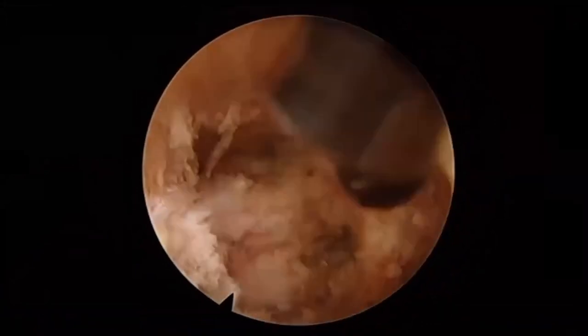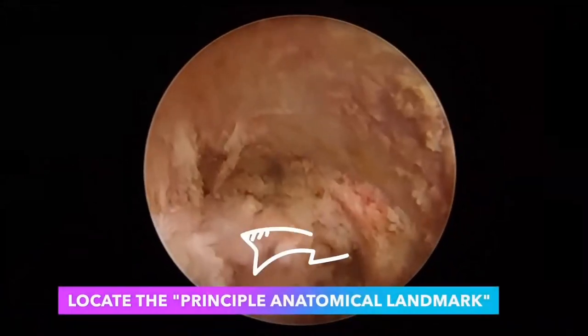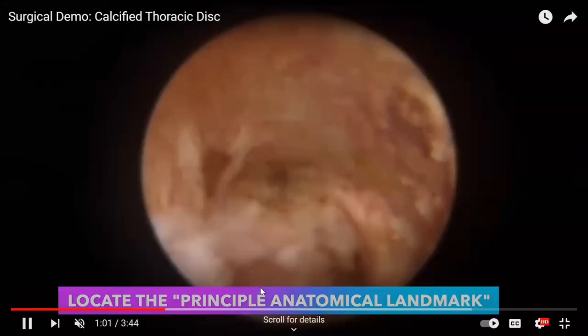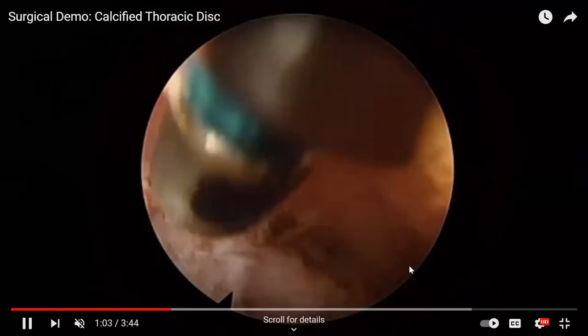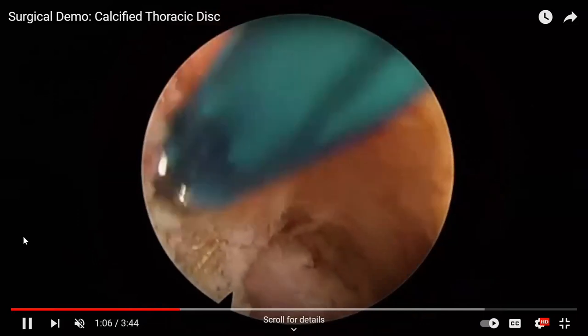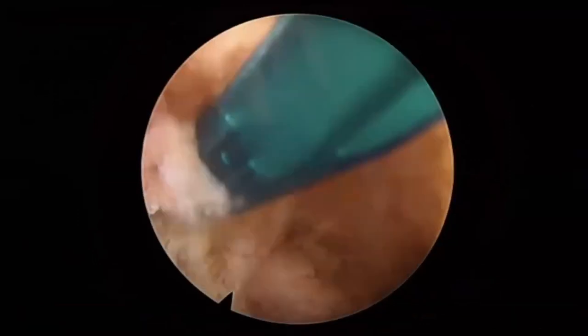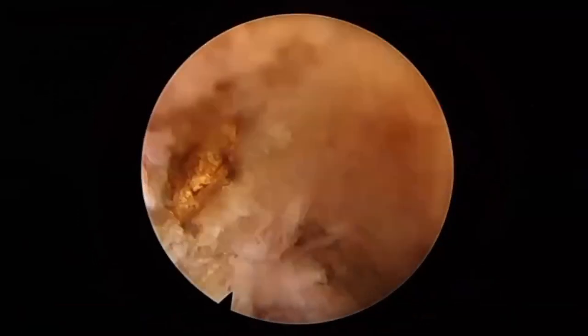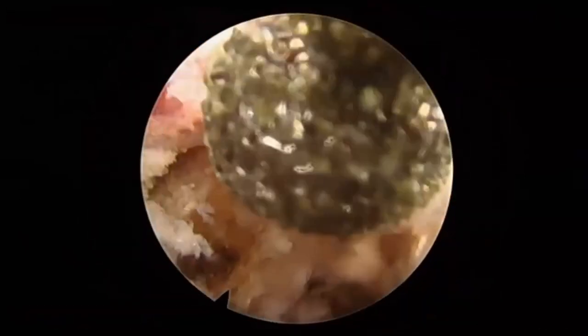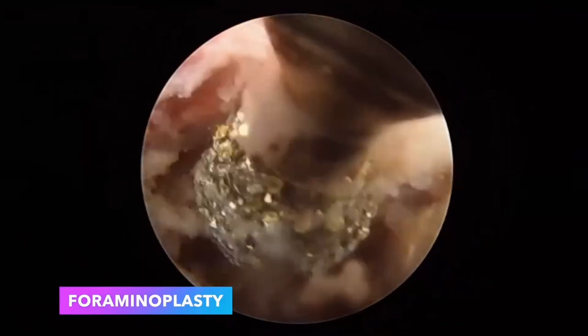The reaming not only helps with expanding your foramen and doing your foraminoplasty, it also helps when you come in, you think, oh, that's the reamed bone, I know where I am here. So that's the principal anatomic landmark. You want to see the SAP-pedicle junction. This is a bipolar instrument, so you're just coagulating everything in there. And slowly over time, you're going to see that the thecal sac will come into your field as you expand the foramen a little bit more.